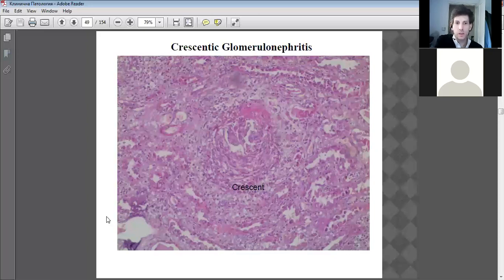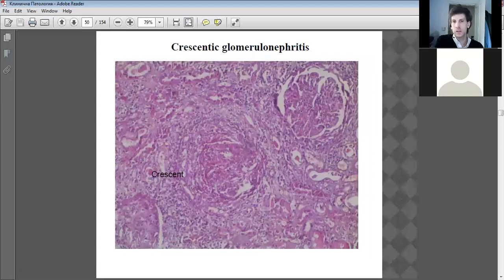Yeah. Oh yeah, necrosis is definitely there. That's necrotic tissue. This necrotic tissue is there, and a bit over there. So the crescent. This is one that's struggling a bit. His glomerulus is still fairly functional, as he's got a good Bowman's capsule, but he's struggling because there's bits of the membrane beginning to break down, beginning to necrose.